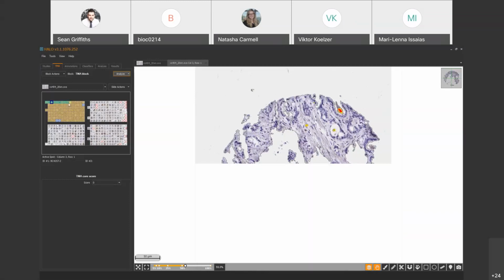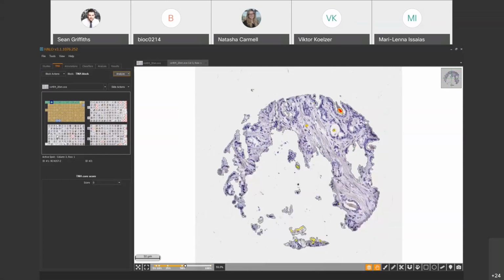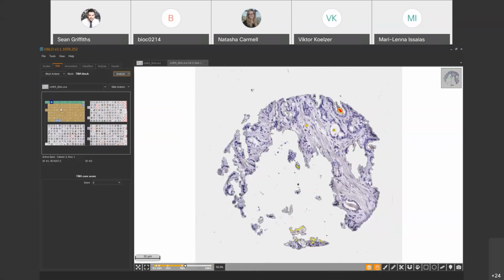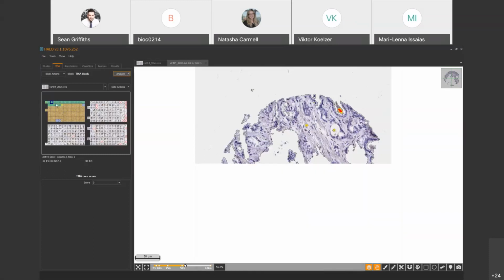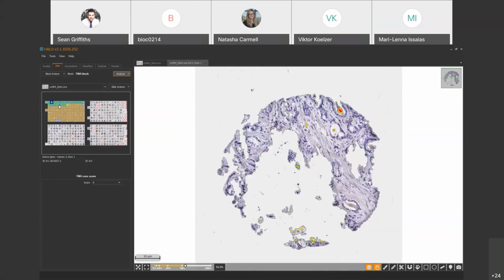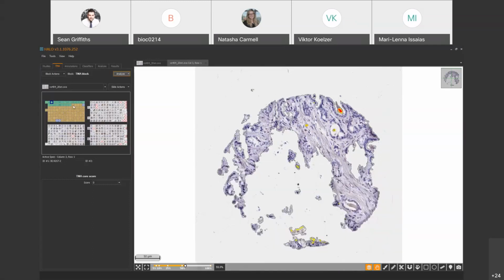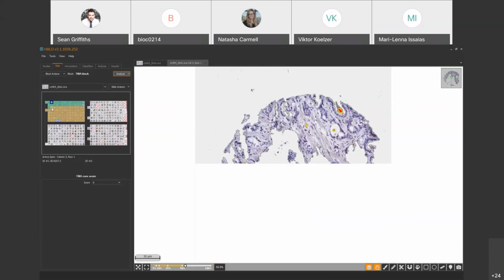So they've updated the color scheme here. It used to be that translucent was cores that were yet to be analyzed. It now seems that you've got orange, green, and yellow, whereas orange is yet to be analyzed. Green is processed and ready to go, ready to be exported. And then you've got a brief incarnation of a yellow spot where that's the process being performed.